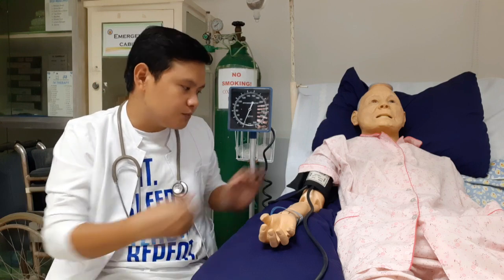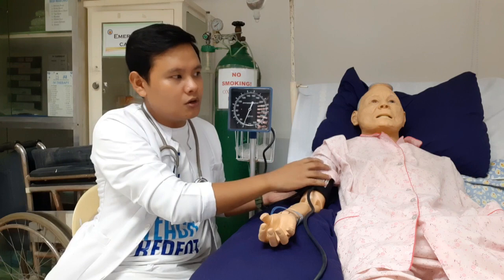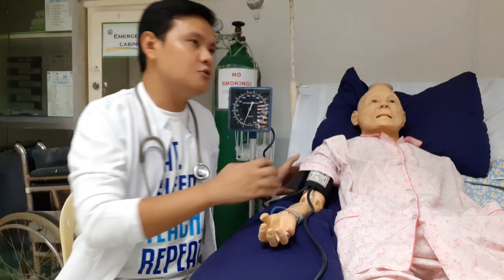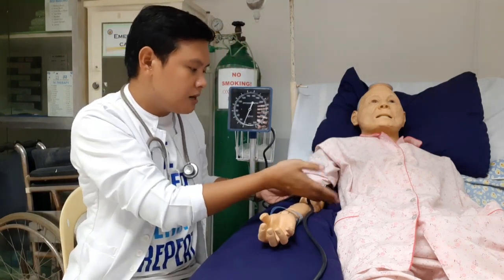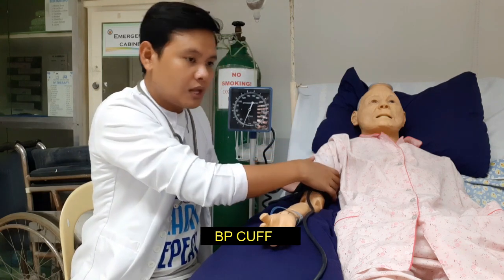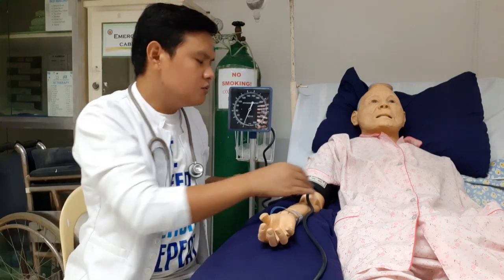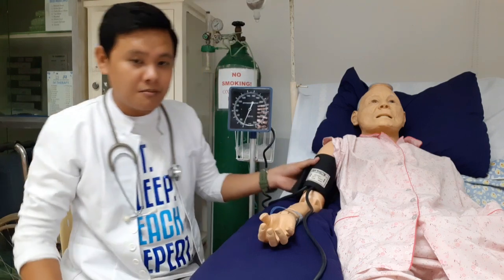Okay, next one, you have to expose the arm kung saan ilalagay mo yung BP cuff. Kung ang pasyente natin naka-long sleeve, as much as possible, unroll natin yung sleeves niya. Katulad nito, yung pasyente ko rito is masyadong mababa yung sleeve, so kailangan itaas po yan. Bakit? Hindi po ba pwede sir na ilagay namin ang sphygmomanometer over the sleeves? No. Dapat dun mismo sa skin mo ilagay. So, ang ginagawa namin dyan, niro-roll up namin ito and then we put the BP cuff. Okay, you have to expose the upper arm.